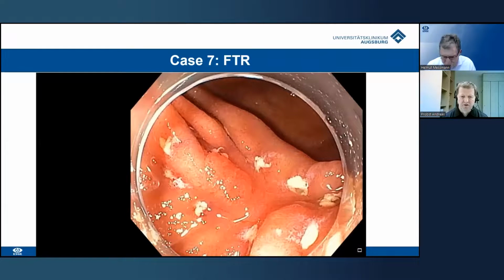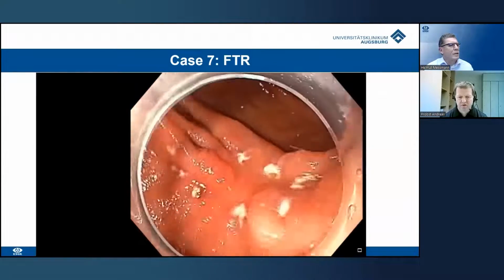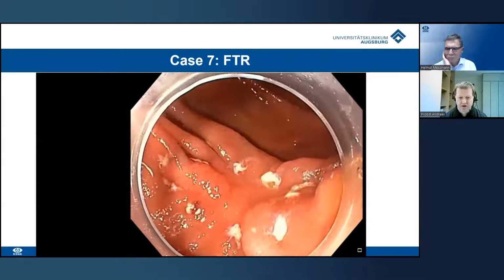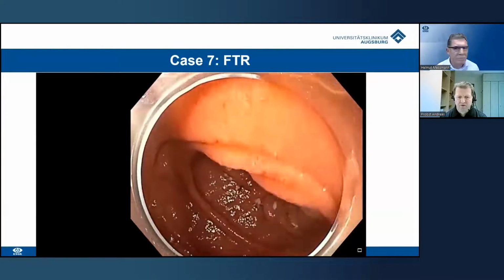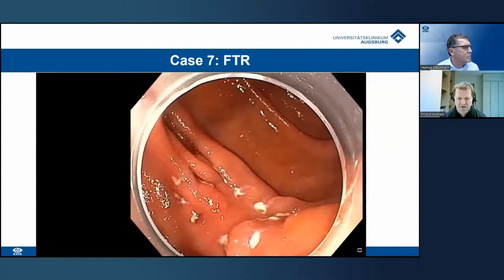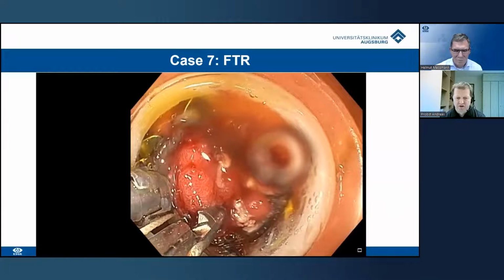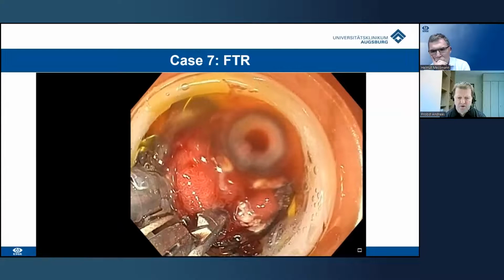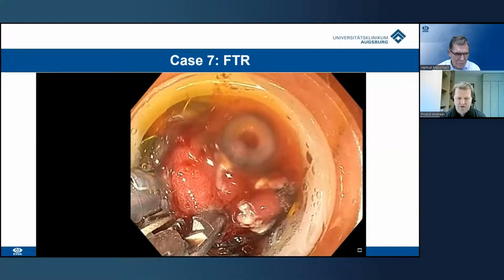The patient had an EMR 2 years ago and repeated EMR and APC 1 year before. And then he had another recurrence with non-lifting. And we decided to perform full thickness resection. And the system is the same as it was developed for colorectal lesions. And there are many data for colorectal lesions now, but only few data for the duodenum. And the procedure is just the same.